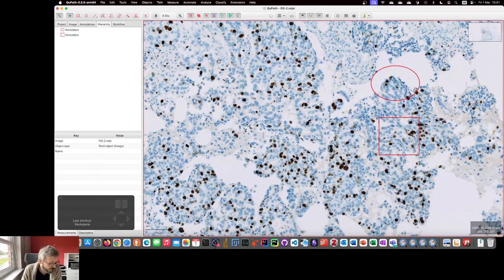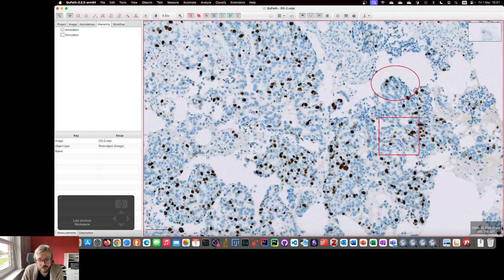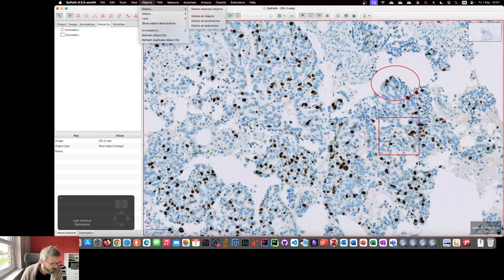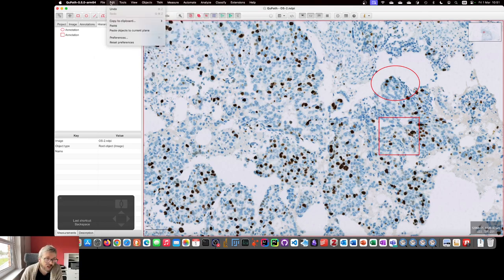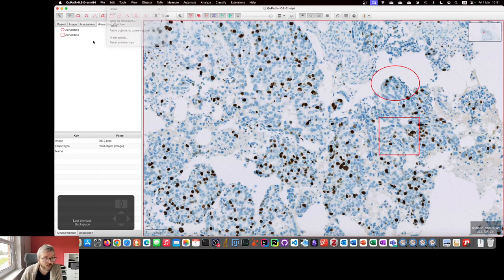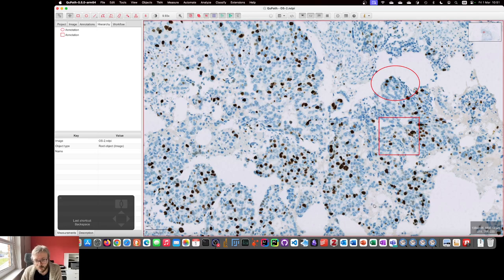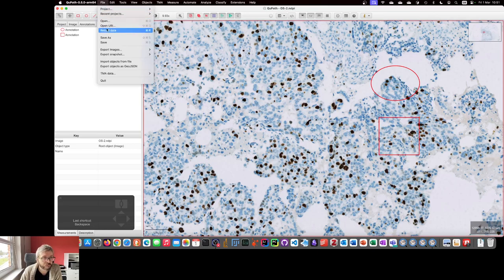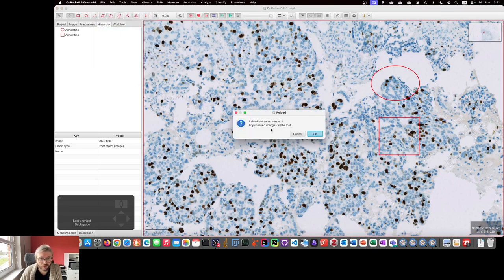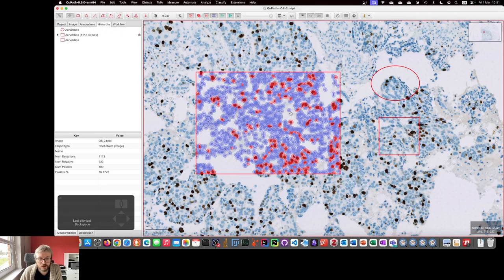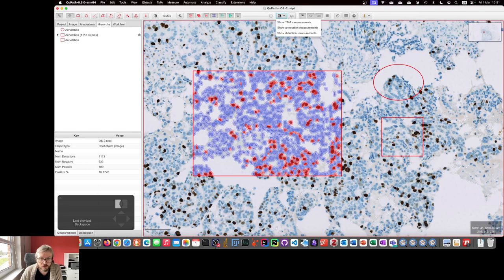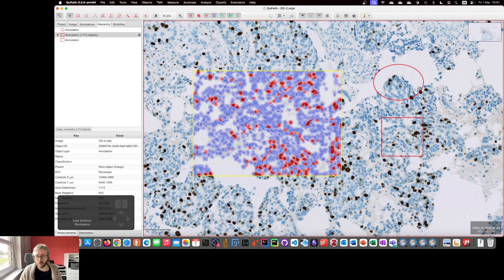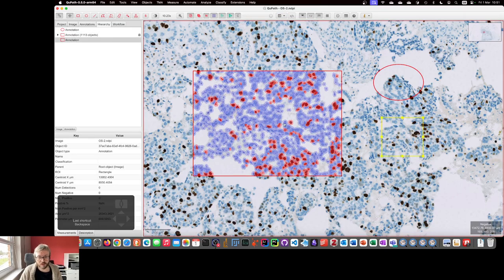So, we have, there are five different ways. We have the objects delete options here. We have the edit undo, which sometimes works and is the easiest when it does. We have the hierarchy where you can select things and remove them. We have the ability to draw new annotations, resolve the hierarchy, and then you've got them in here as well to work with. Or we have selection mode as a quick way to select objects based upon drawing. And we can get rid of them that way. Okay. So, there's just another couple of little things that I want to show briefly on the video.